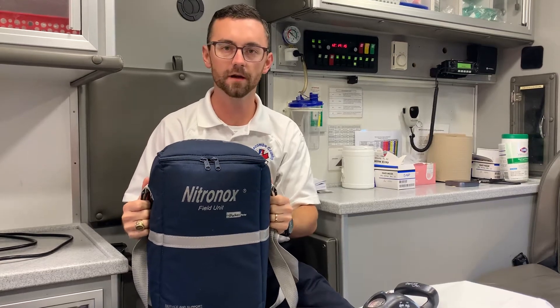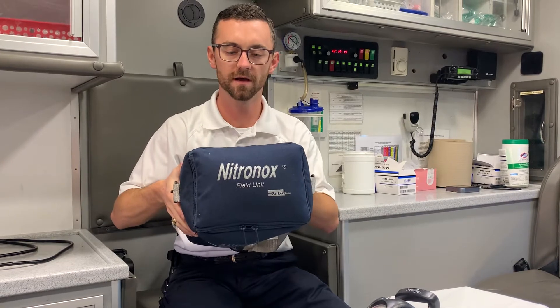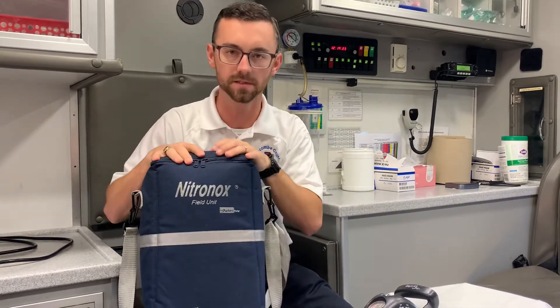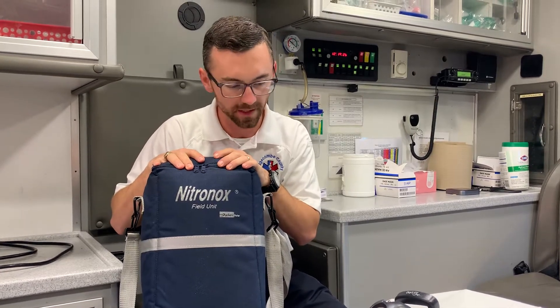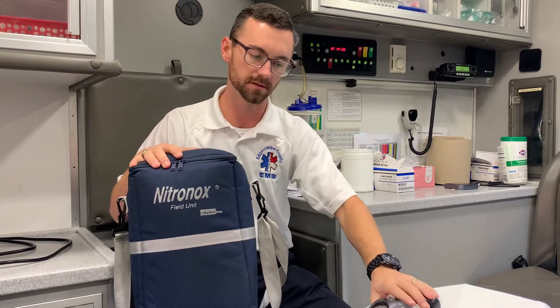This is the field training for the nitrous oxide system, the Nitromox field unit. What you have is this pack, which is carried on the Medic One truck, and the only other thing that you will need to make the system work is a full oxygen tank.